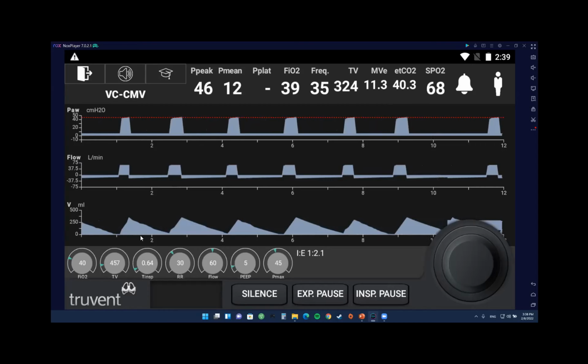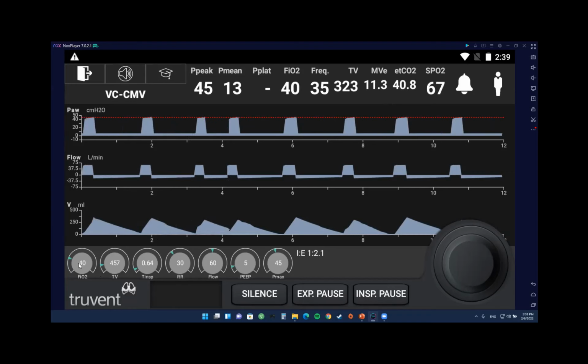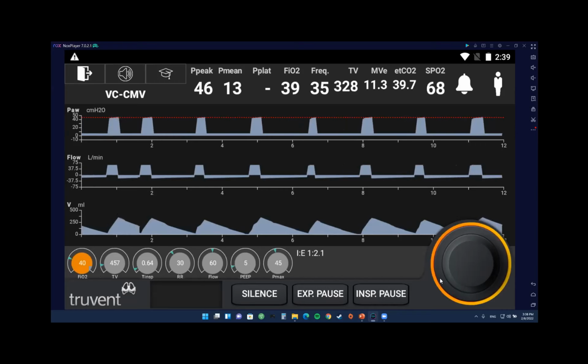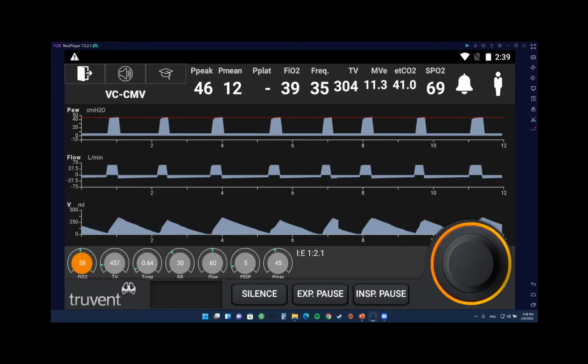Yeah, because it's an oxygenation issue, right? It's not really a ventilation issue and he's not getting enough oxygen in general. We have room to go up on either his PEEP or his FiO2. Which one do you want to do? FiO2 first. Okay. How much? I would bump it up to 100 just because he's sitting at like 70%.